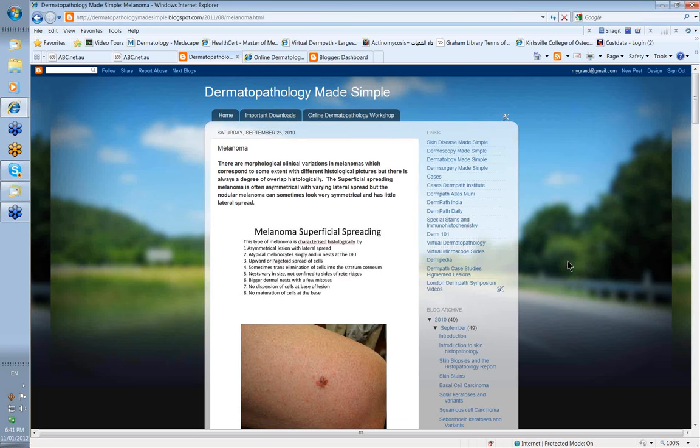There are a whole variety of different histological types of melanoma, and perhaps the most difficult for a pathologist to diagnose is one called the nevoid melanoma. We may come to that a bit later. It's one in which, at a superficial level, the arrangement of the melanocytes looks more nevoid, nevus-like, rather than melanoma. But what we're going to deal with first is the superficial spreading melanoma.